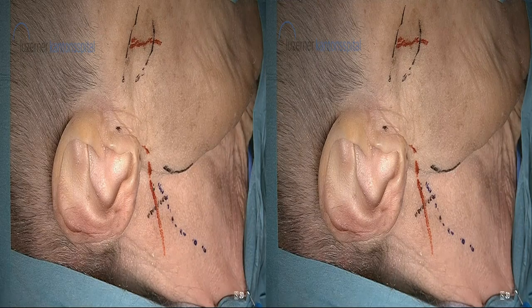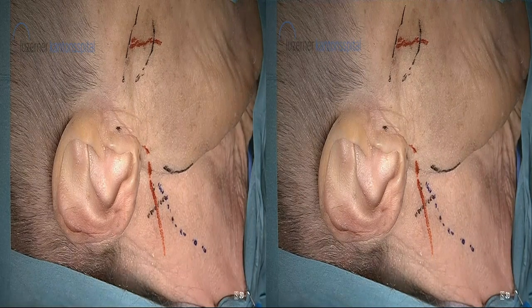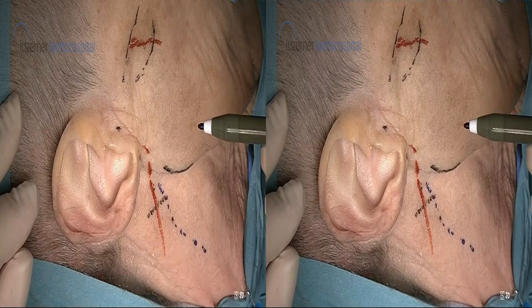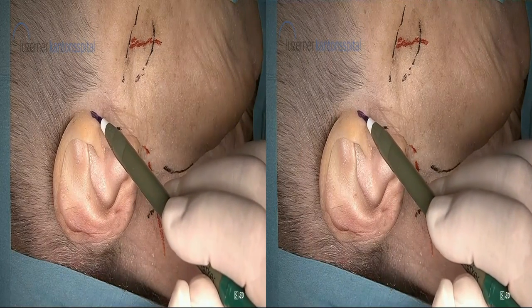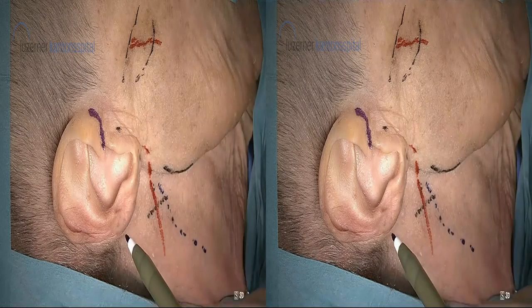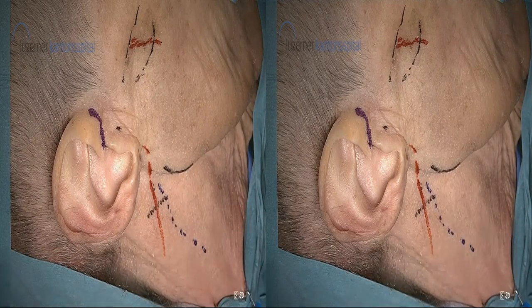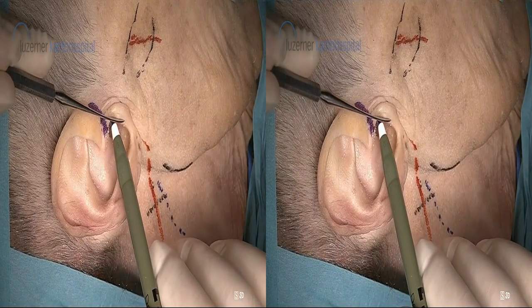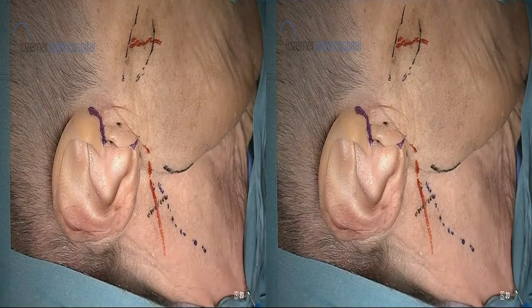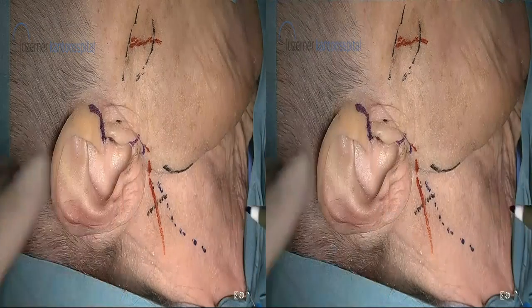Having these landmarks, it now depends on what procedure exactly you're planning. We can now do the skin incisions. It is nice for any parotidectomy to have an incision which is almost not visible. Almost not visible means that we start anteriorly to the ear, and then, like in the endaural incision, we go between the tragus and the root of the helix. We then pass with our knife underneath the tragus. So we will put the tragus a little bit forward and then underneath the tragus about two or three millimeters. This scar is hidden here. We then exit again at this side and go around the earlobe. And now we have two options.